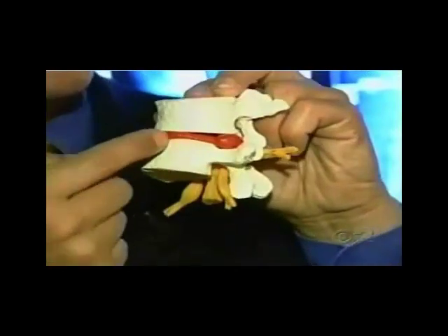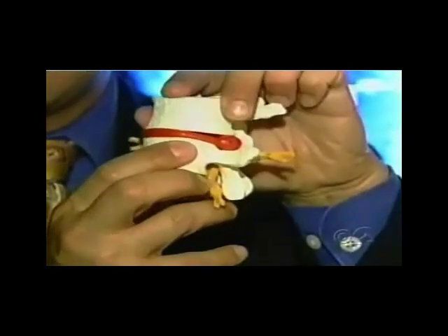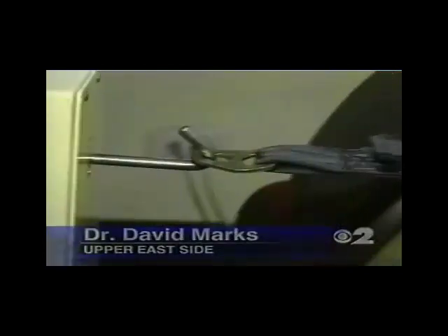When a disc herniates, the soft center bulges out, and this can push on the nerves. The idea behind VAX-D is it pulls apart the spine. This creates a vacuum that draws the disc back into place. Patients lie on a computer-controlled table that applies gentle traction to their spine.